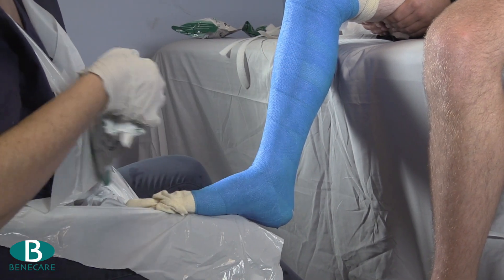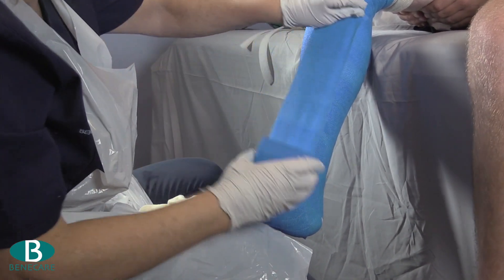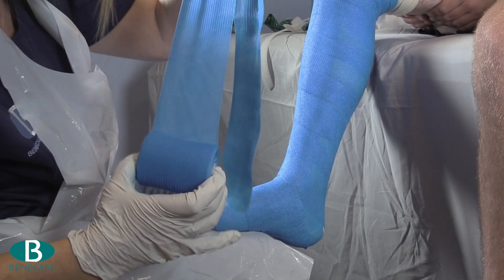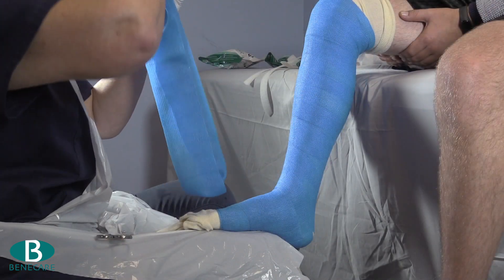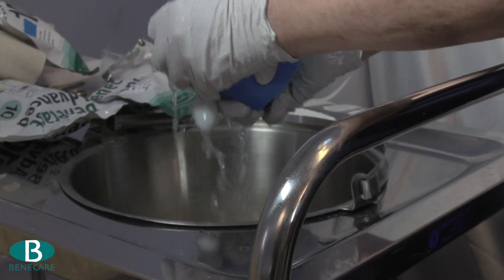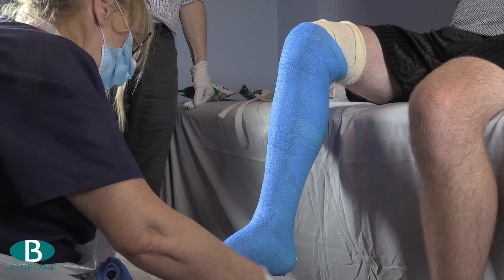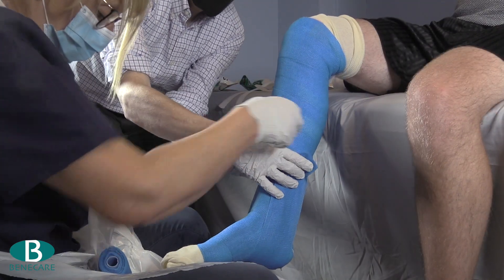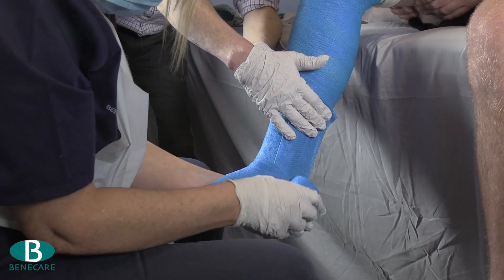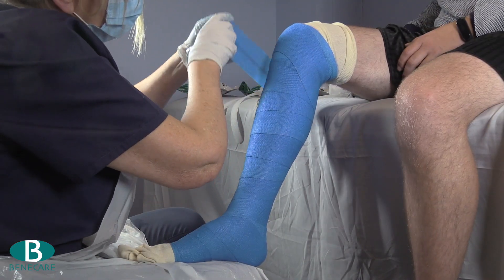Now, dependent on the size of the limb, use either a 10cm or a 7.5cm BennyCast Advance to make a two-layer stirrup. This should come above the fracture site. Position the stirrup onto the limb to fit under the heel and up the medial and lateral border of the leg. Secure the slab using the remainder of the bandage, wrapping edge to edge working from the foot up the leg.